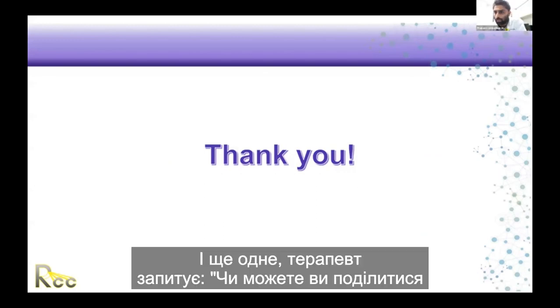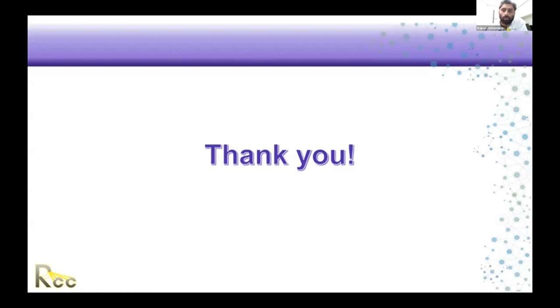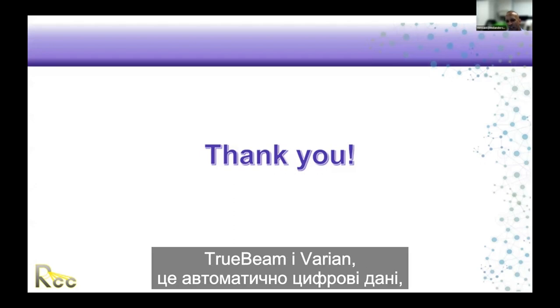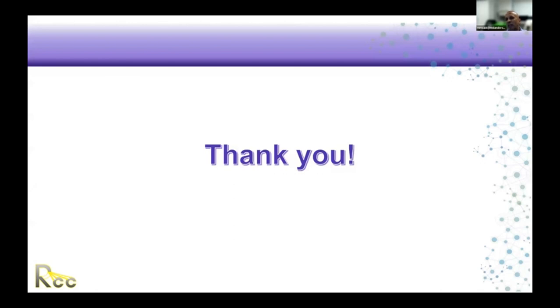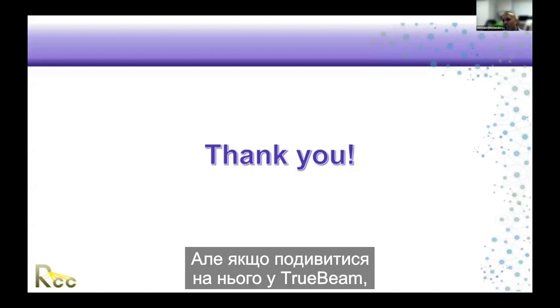And one more, the therapist is asking, can you share your imaging frequency table for the different treatment sites or techniques? Do we have any protocol? We don't have that protocol because now, like I said, this is TrueBeam and Varian, it's automatically digital. But what we could do is, if you want, I could build one. The only problem is it depends on the machine. For example, on a Varian 2100, for the brain your kV is 100, but on a TrueBeam, your kV is 85.